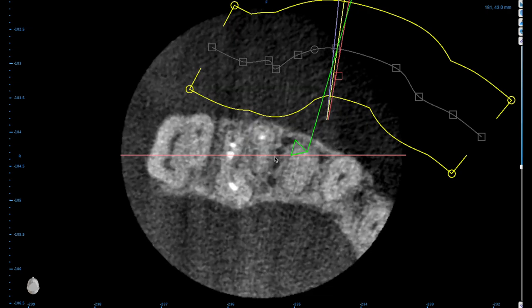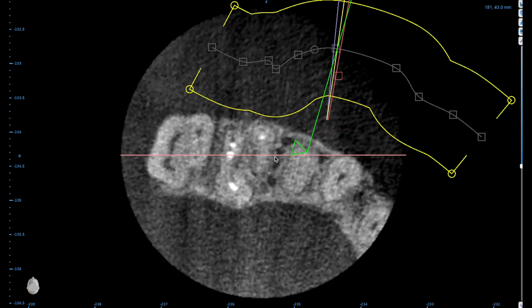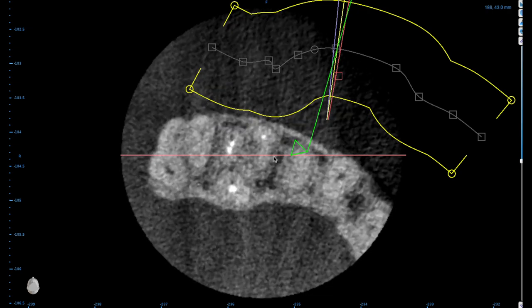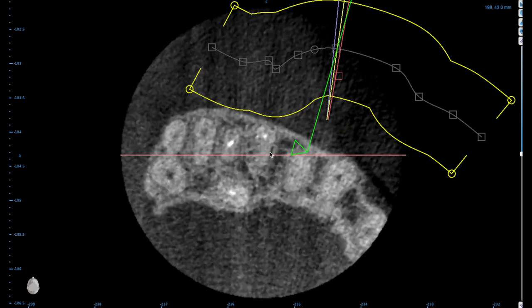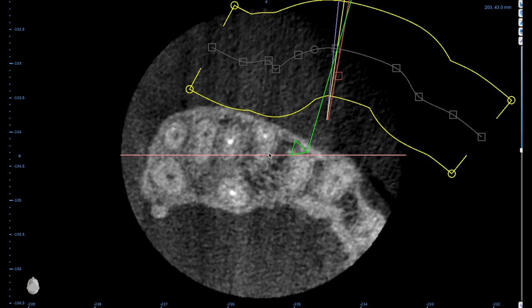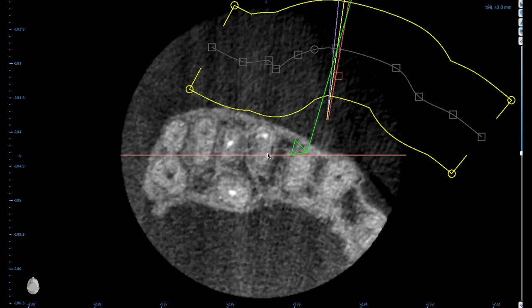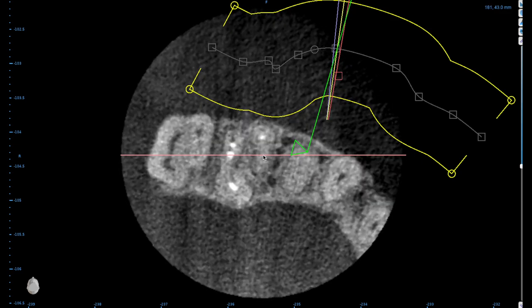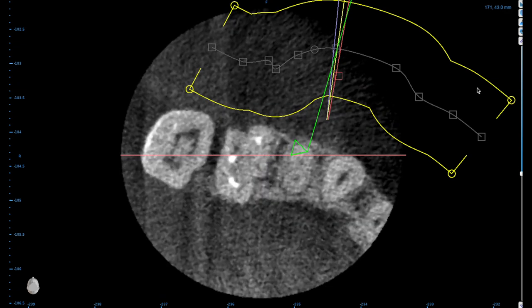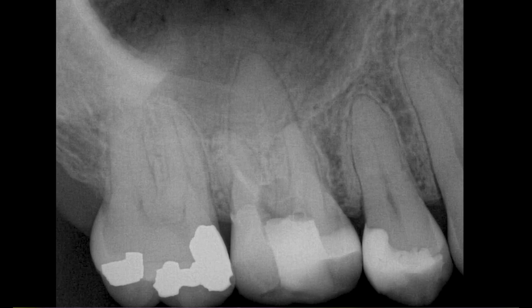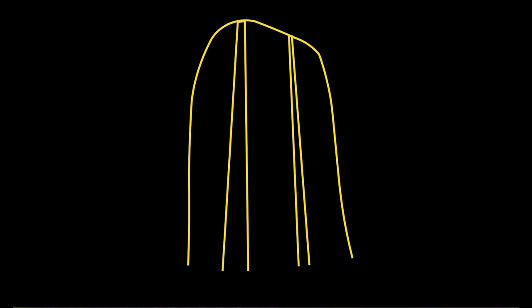I know that my Muntz burrs, that's what I typically use. I don't use a lot of ultrasonics, it's another thing for me to have around and break. The burr is either a half millimeter or one millimeter. So I know that I've got some playroom here to look for MB2. And this number, 2.36, actually played a significant role. If you're looking for these really tiny canals, it might be really helpful for you to measure. It gave me a little bit of confidence.